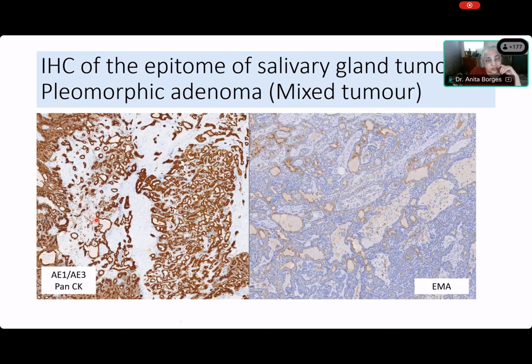All right. You don't see anything else, Akshara, that has taken up pan-CK? You see these little cells that are in the myxochondroid stroma? Can you see them, Akshara? Yes, ma'am, I can see. So are they positive? They are positive. Right. Do you see? So what are they? Myoepithelial cells. So what is your problem over here?